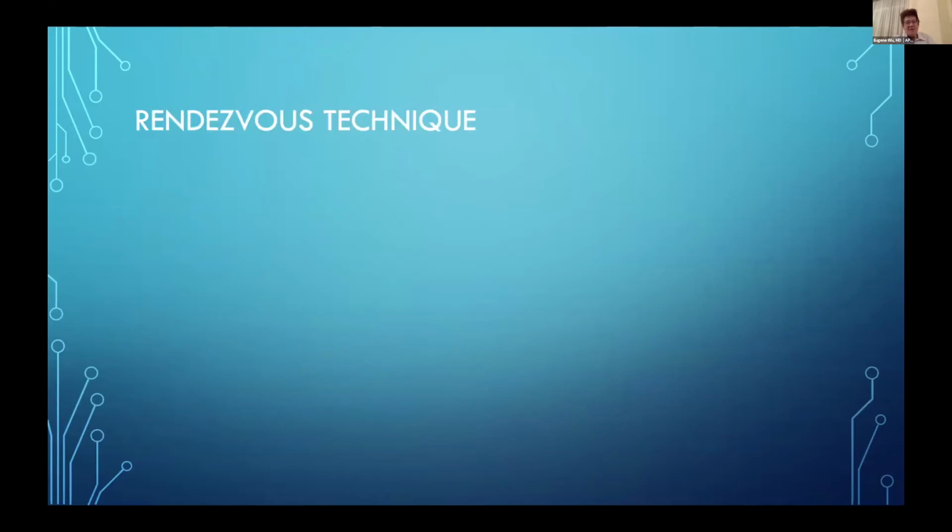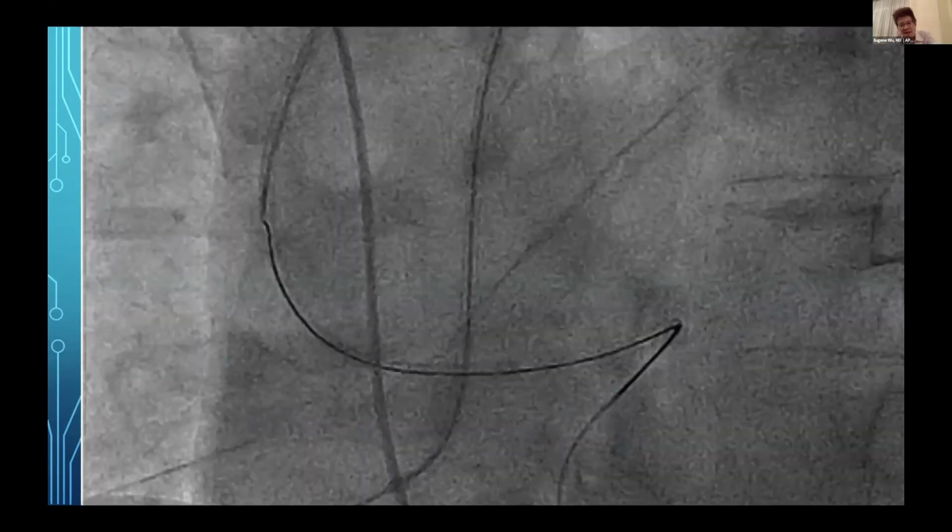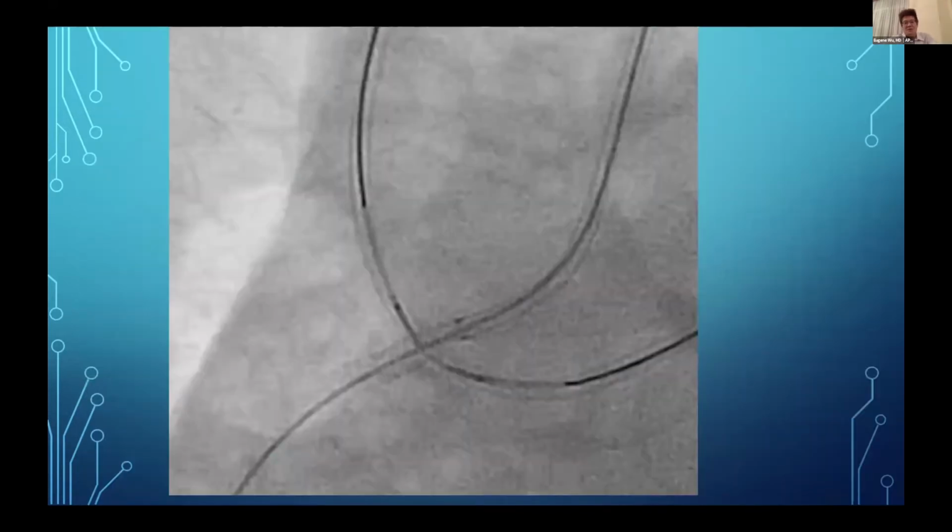So the rendezvous technique, basically at the outer side of the curve, that's where you can get both wire and retrograde antegrade microcatheter to connect. So always wire to the outer side. This is a very silly case I did many years ago. I've already got the retrograde microcatheter inside the antegrade guiding, but I want to demonstrate that it's at the outer curve that I can easily do it. So I actually had a video, which I've lost unfortunately, in which I keep wiring one way to the other way back and forth 4 or 5 times just the first time to demonstrate that at the outer curve of the guiding catheter it is easy to do rendezvous.